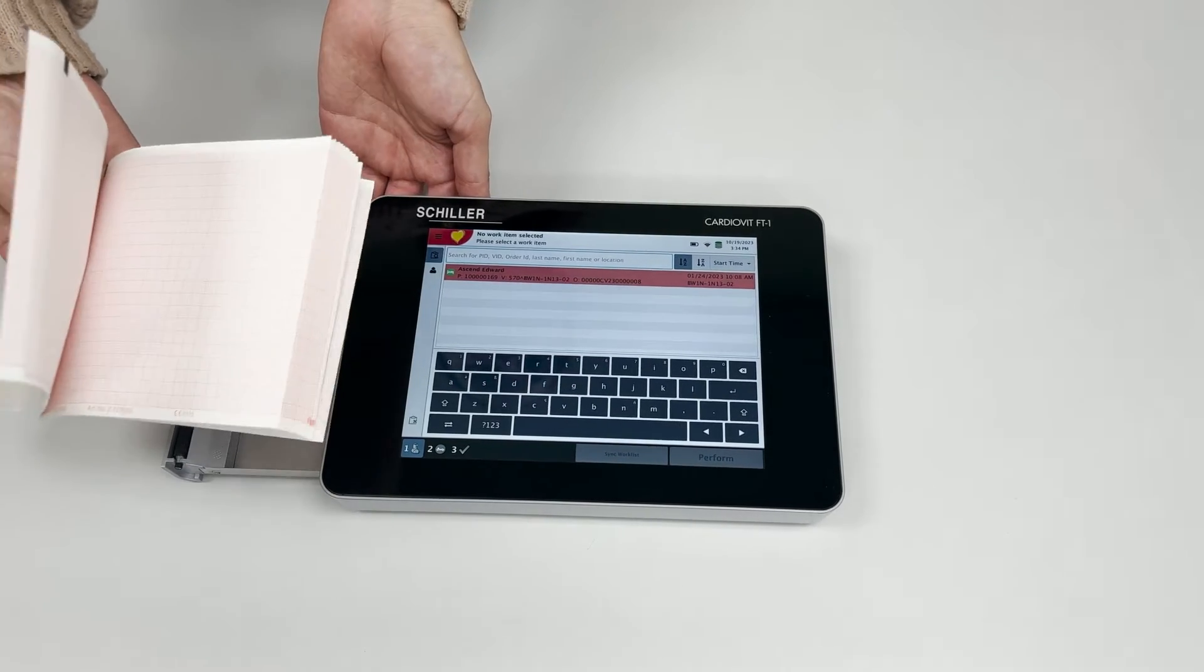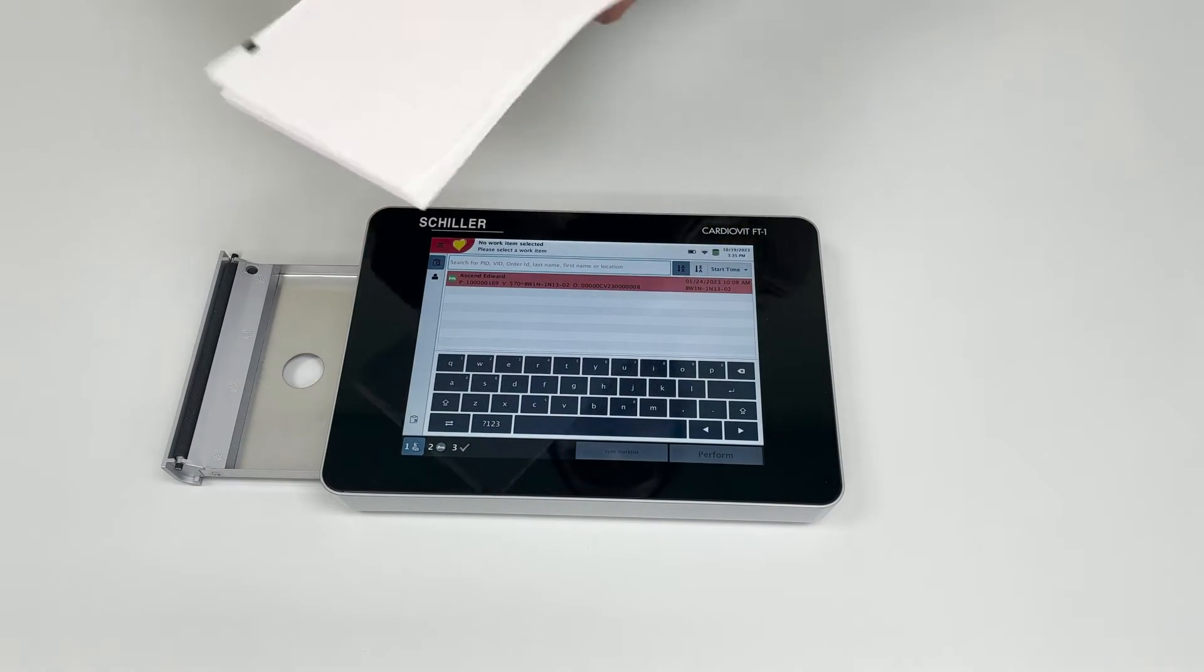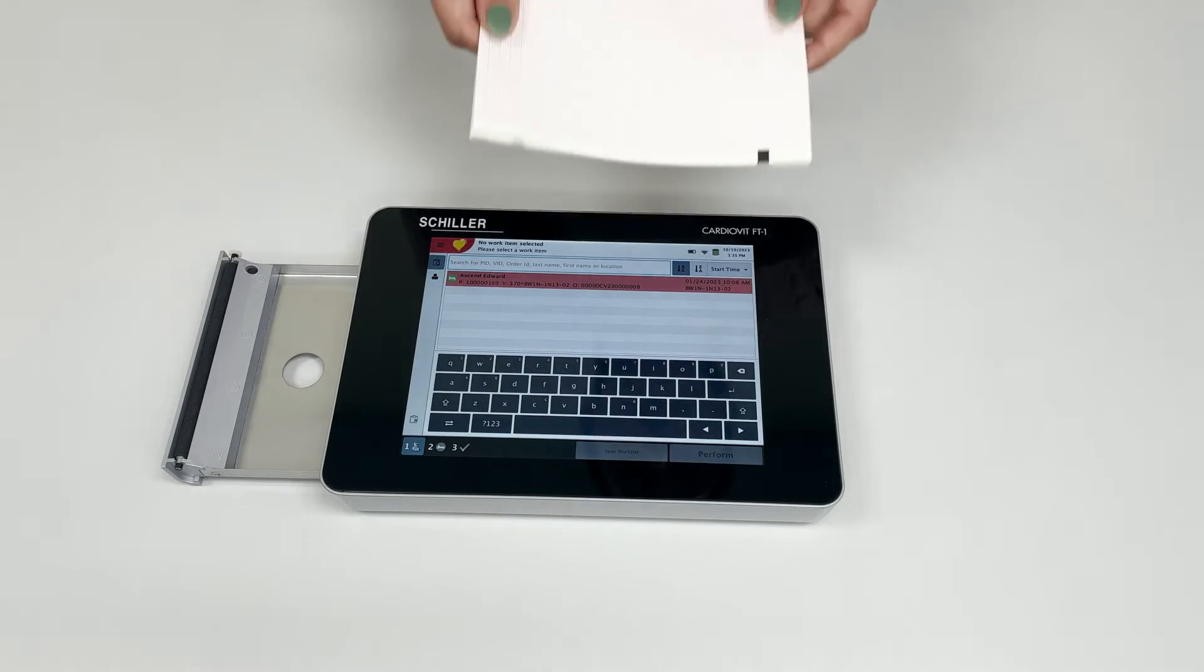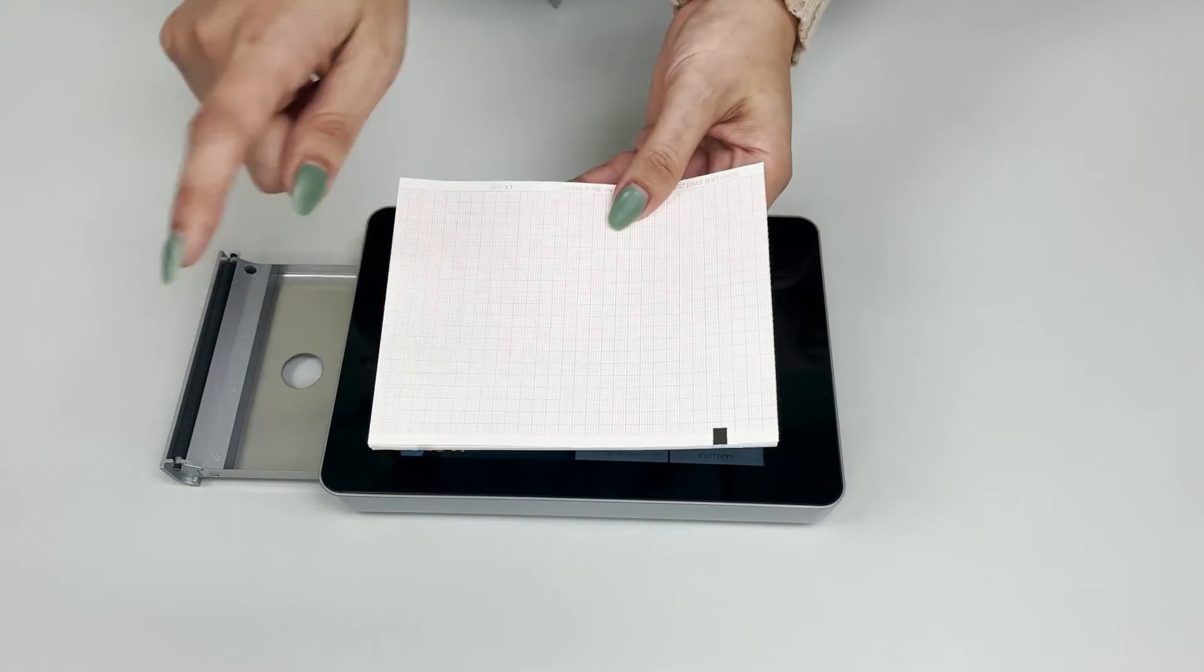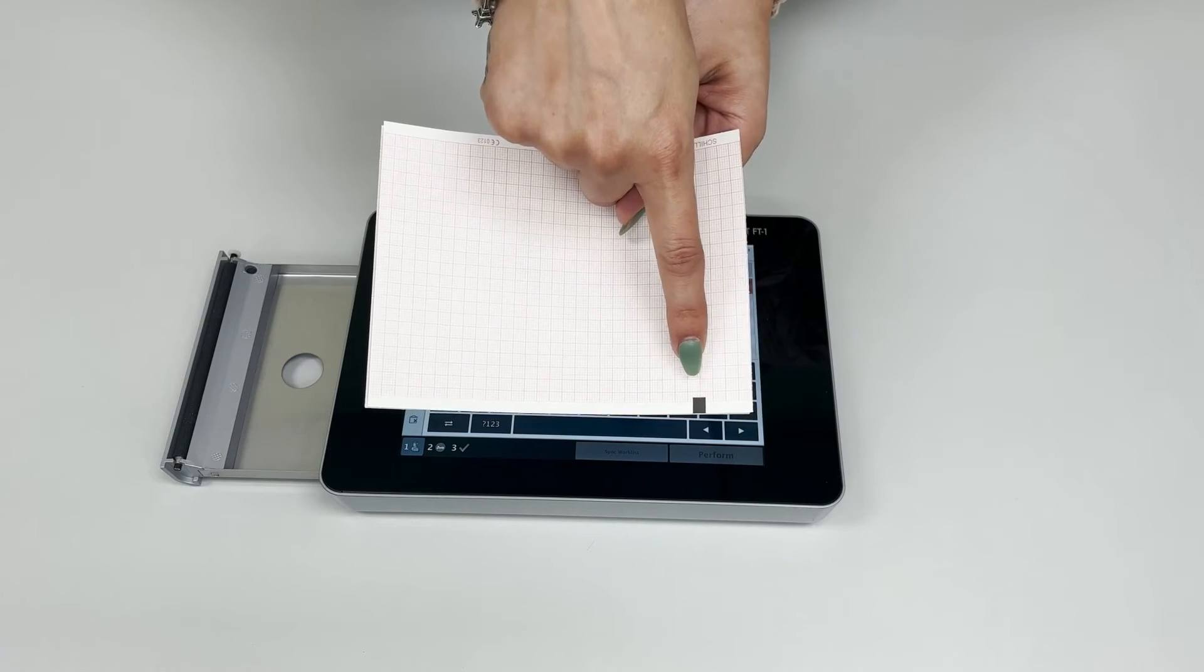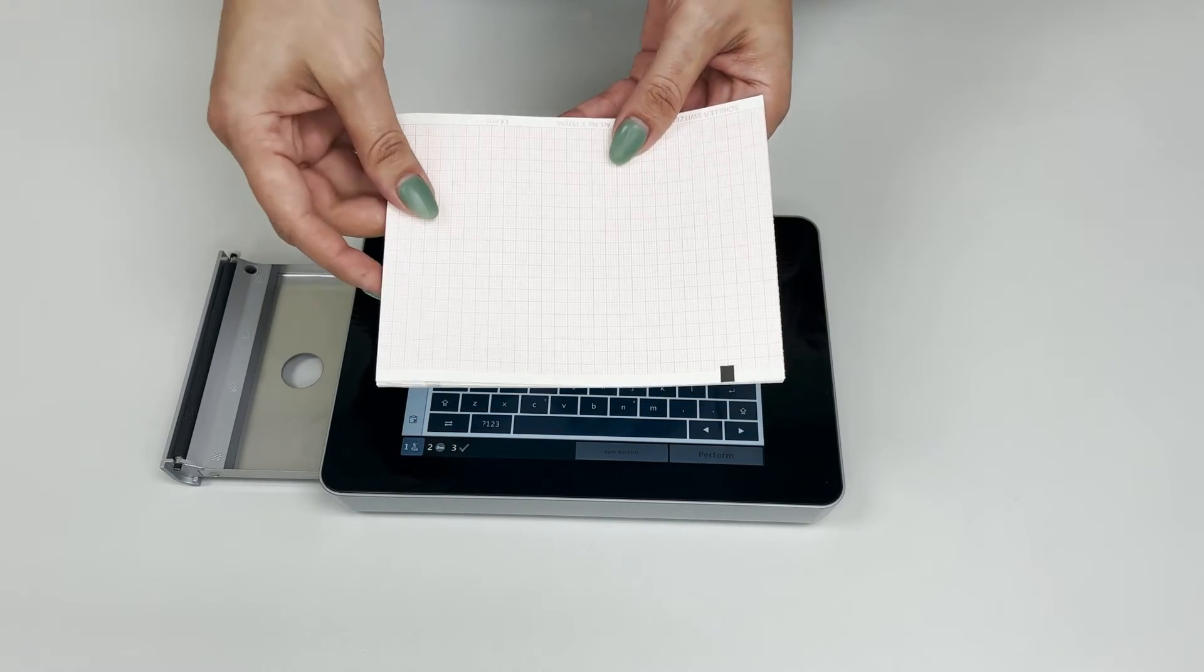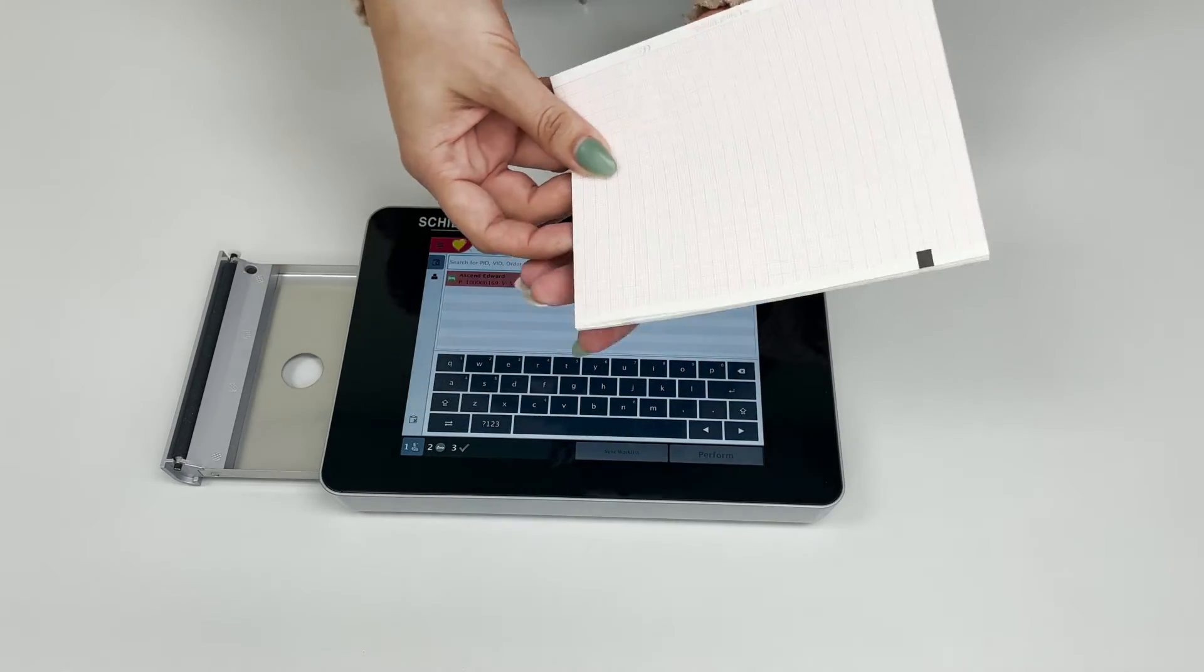If you insert the paper incorrectly, for example placing the registration mark at the bottom instead of the top where it belongs, you will encounter some issues. Give me a second and I'll show you now.